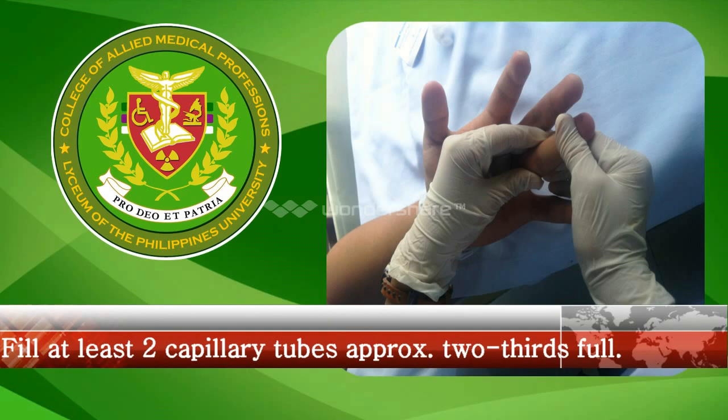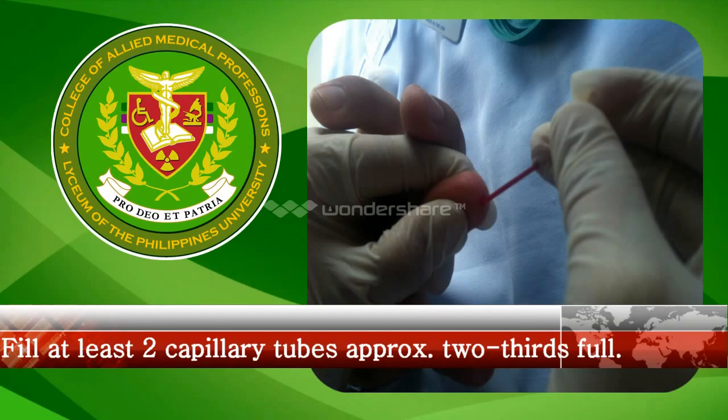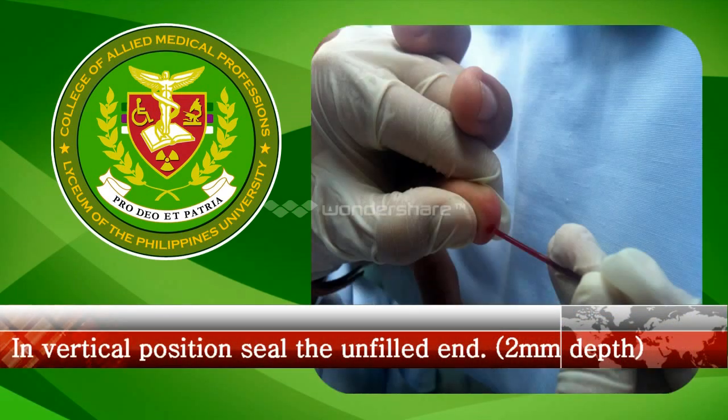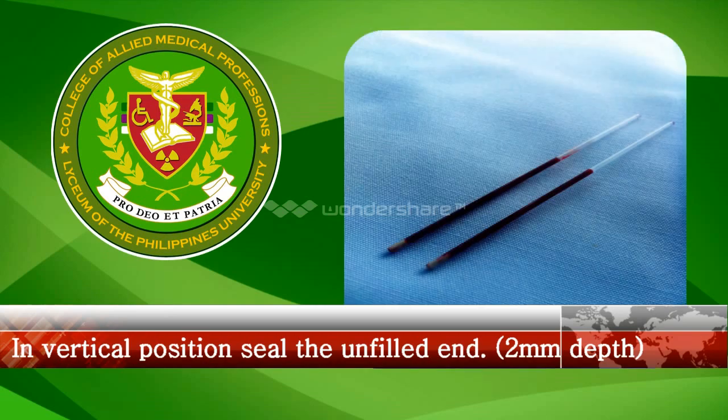First, fill at least 2 capillary tubes approximately 2/3 full. If using tubes with a colored ring at one end, fill from the opposite end. In a vertical position, seal the unfilled end or the end with the colored ring with sealing clay. Make sure that it is completely plugged to a depth of about 2 mm.